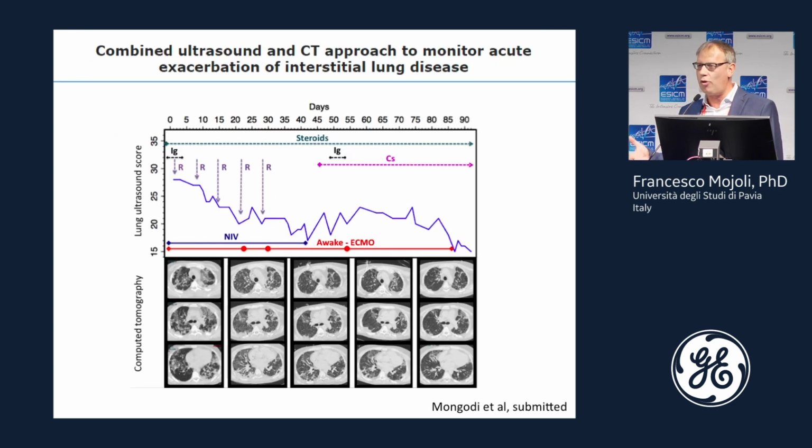And this is a very prolonged monitoring along almost 3 months of awake ECMO. We performed 5 different CT scans in this patient, and we used lung ultrasound to fill the gap between 2 CT scans.